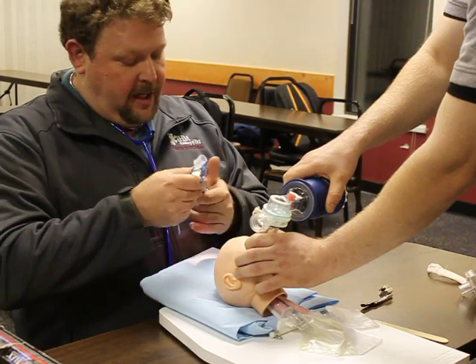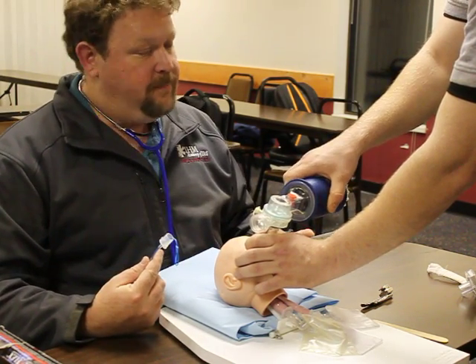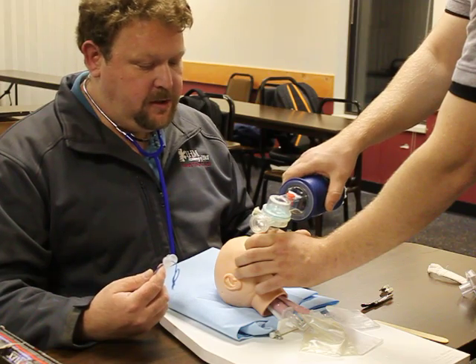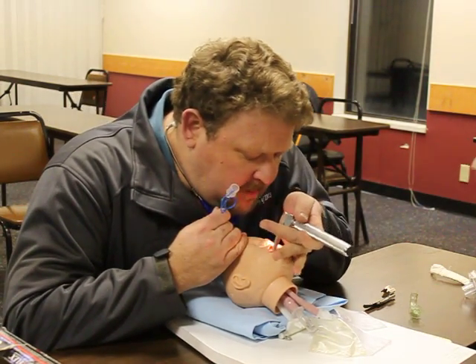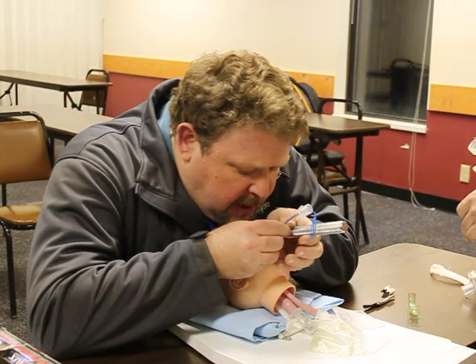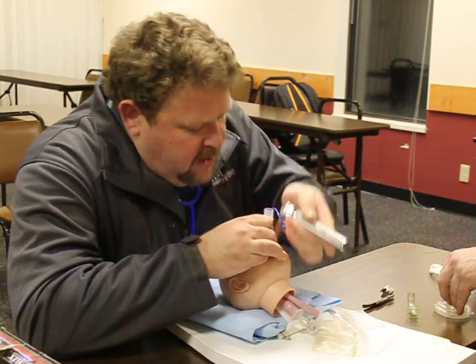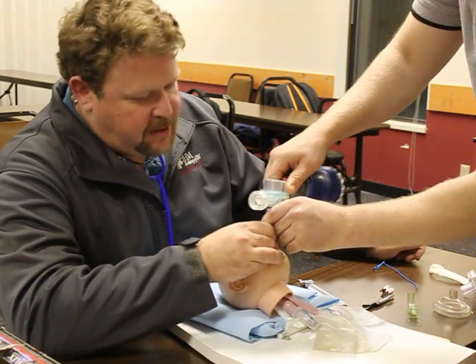I'm going to go ahead and direct my partner: on my count of three, I want you to go ahead and remove the BVM, remove the mask, and remove the OPA. Are you ready? One, two, three. I'm inserting my blade, I'm visualizing the glottic opening, displacing the jaw — I can see my tube passing into the trachea. Go ahead and ventilate, please, as I remove the stylet.